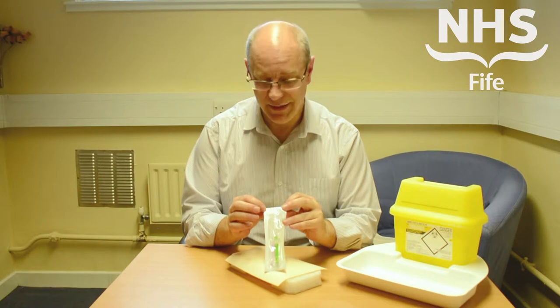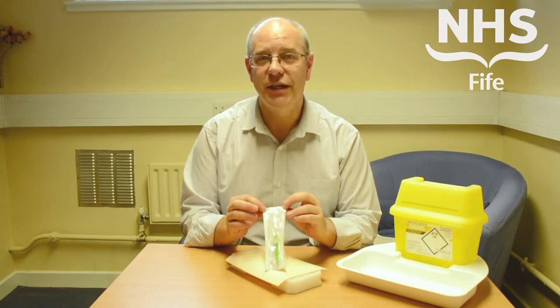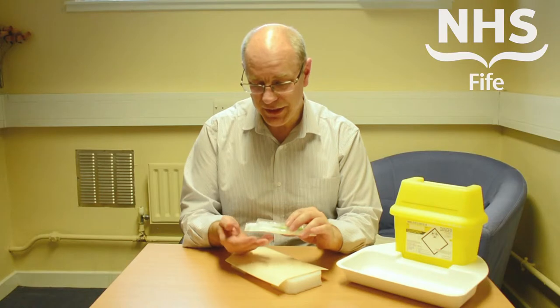A critical thing to remember with these particular devices is to check that the device is in date before you use it. That's a particular patient safety issue.